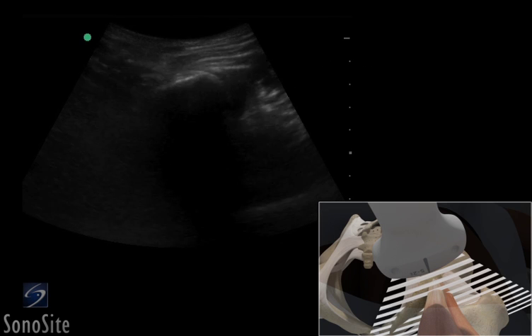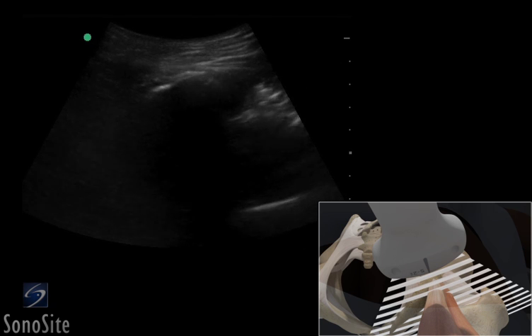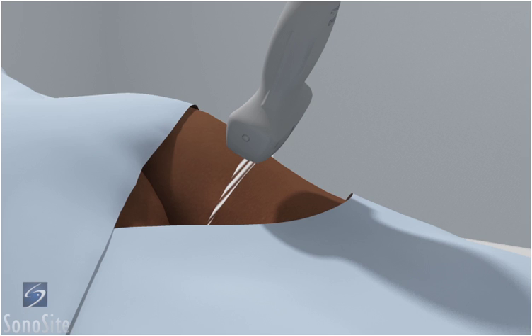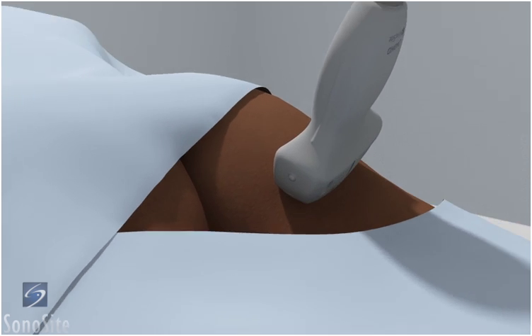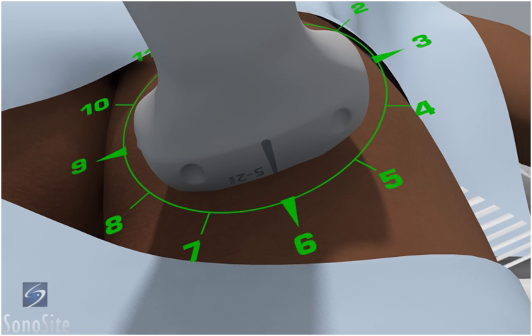A curved array transducer with a musculoskeletal exam type is used to perform an ultrasound-guided injection of the proximal hamstring muscle. The patient is in a prone position with the leg slightly abducted. The transducer is placed transversely over the ischial tuberosity with the orientation marker directed to the patient's right at a 9 o'clock position.